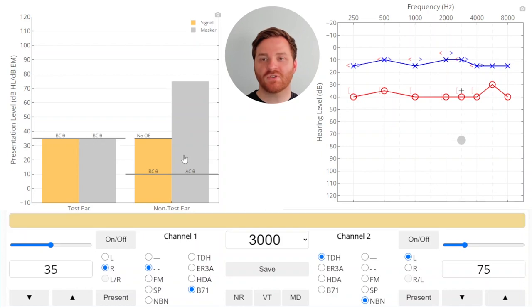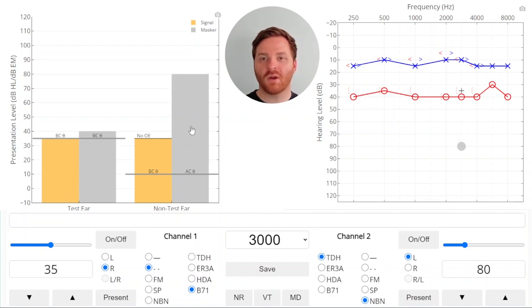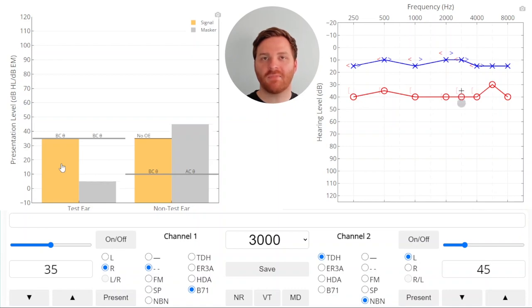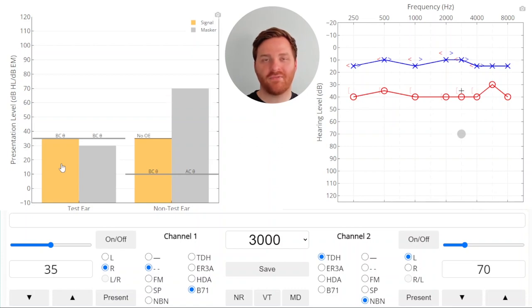At some point, you can raise the masker so much that you're overmasking — in other words, the masker is presented at such a high level that it crosses over to the test ear and covers up and raises the threshold of that test ear. If you present so much masking that you're overmasking, you've gone too far. The goal of the plateau method is to find the point where you're at the true threshold and effectively covering up the non-test ear, but not presenting so much masking that you're overmasking. This is effective masking. I know it can be confusing to think of masking in a new way, but I really hope that the masking tool helps you see this differently. If you want more videos with the masking tool, just shout out and let us know. Good luck and have fun using Theta.